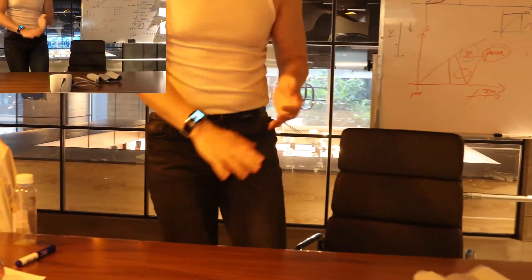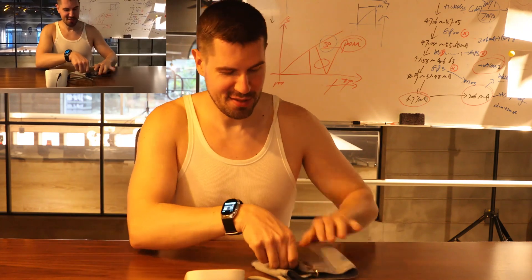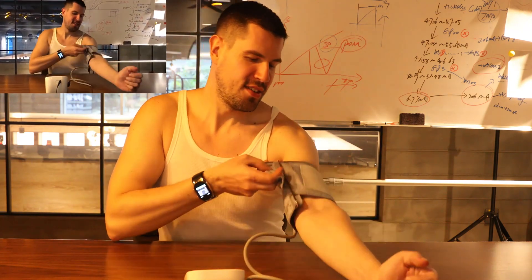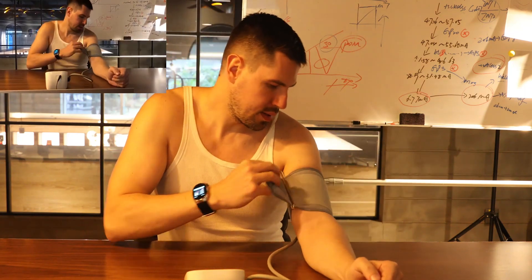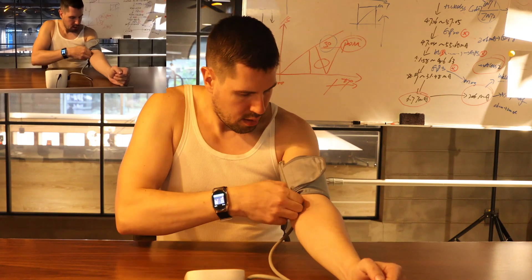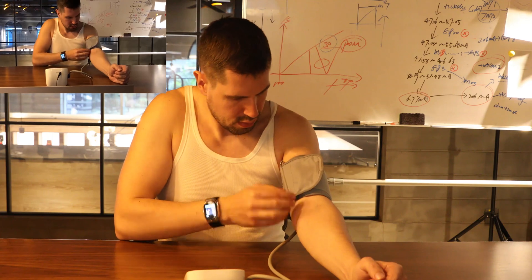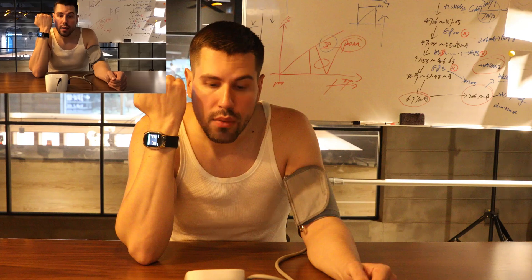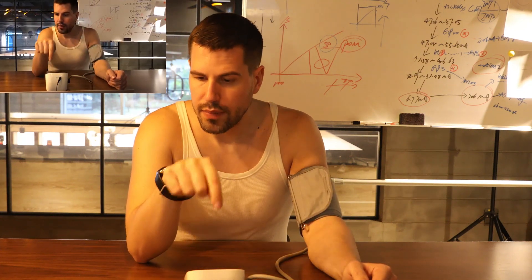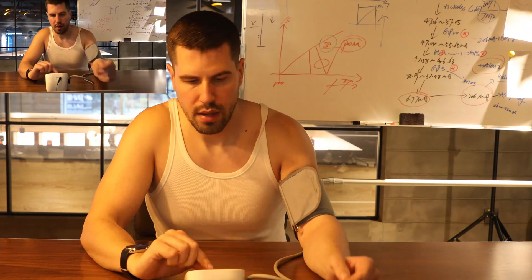I think this is enough. So, a very important thing — you need to make sure that everything is plugged in. Our smartwatch has one big advantage: it's on you all the time. So we are already here, it's plugged in. We start to measure — one push here, another here.